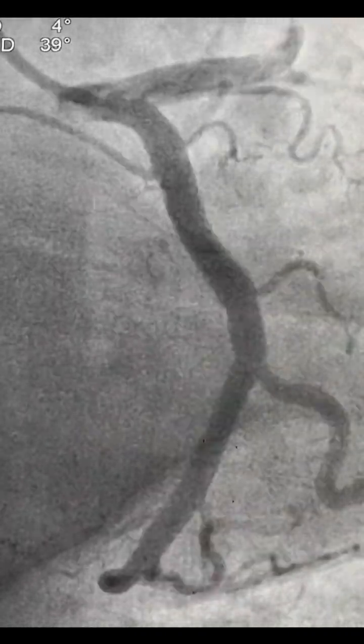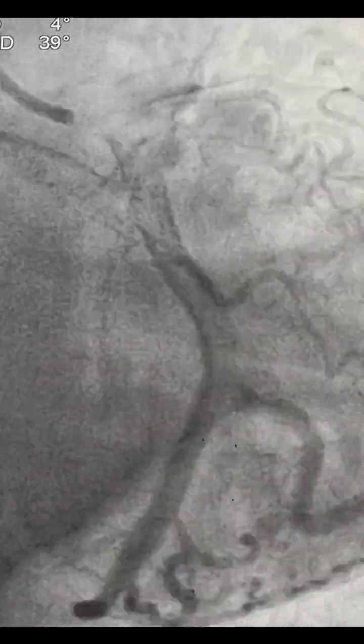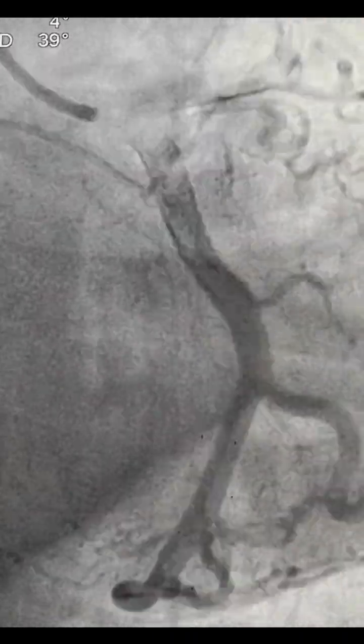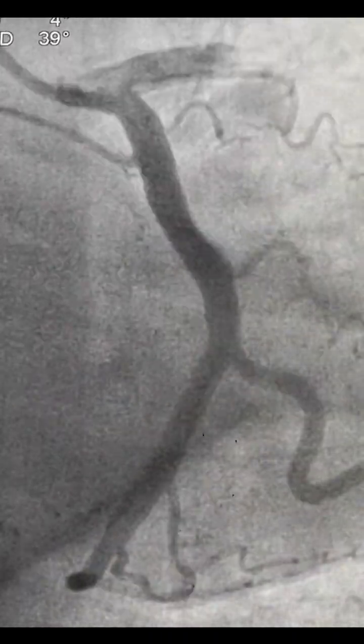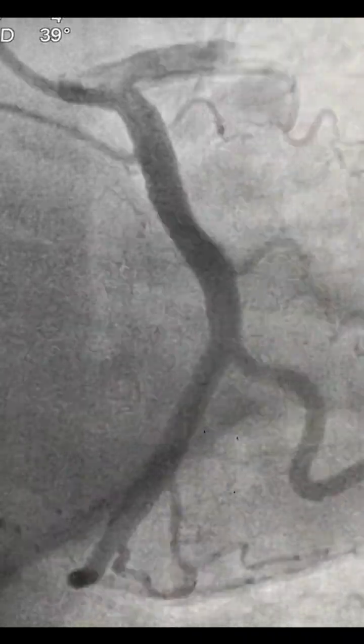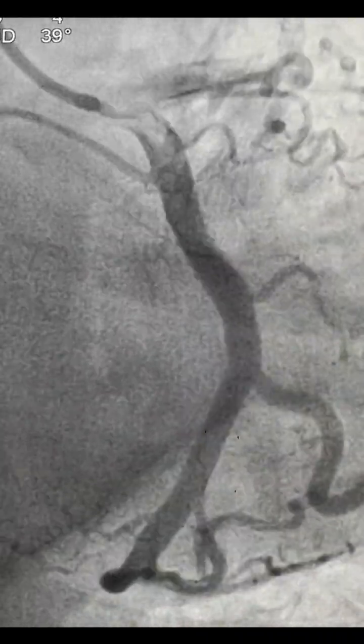And this is the final picture after the NC in the distal and proximal LCX. So this has always been a problem in large ectatic vessels, the availability of stents and all. So this was the angioplasty to this LCX.